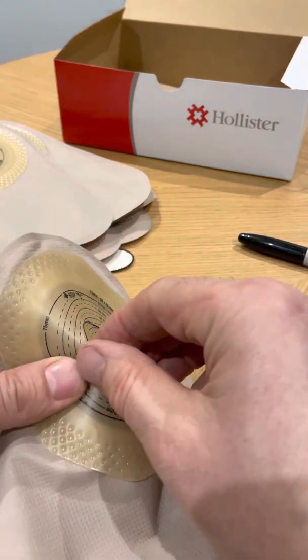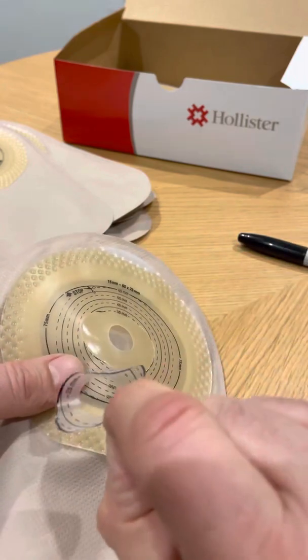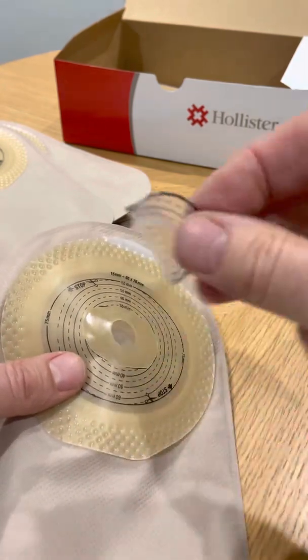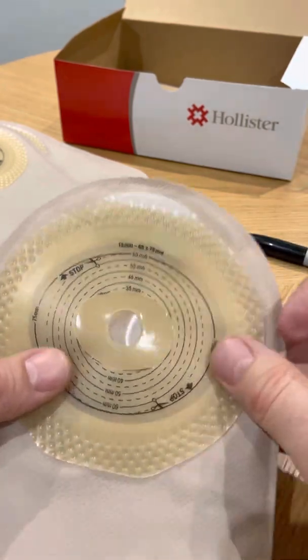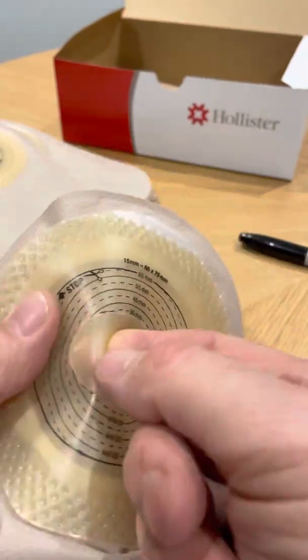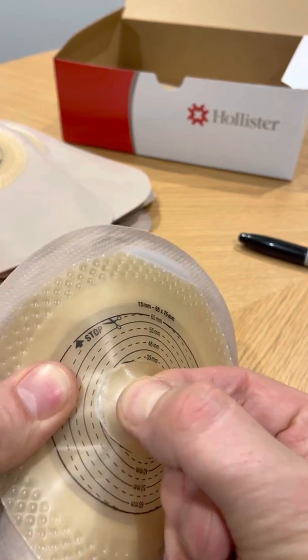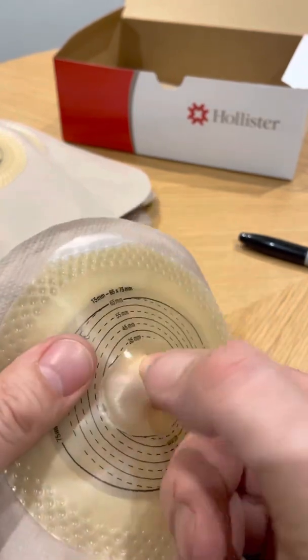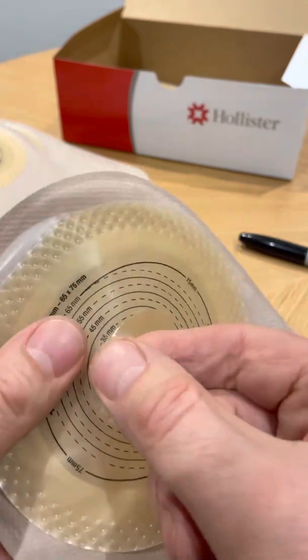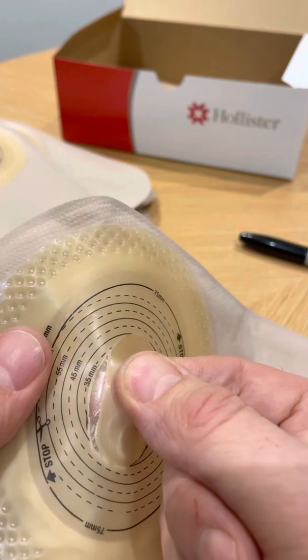So now you can peel off the outermost piece, discard that, and here comes the magic bit. You put your finger in the hole and then gently pull away from the side the material, and continue this all the way around. And this is where you can check that your scalpel hasn't gone all the way through.